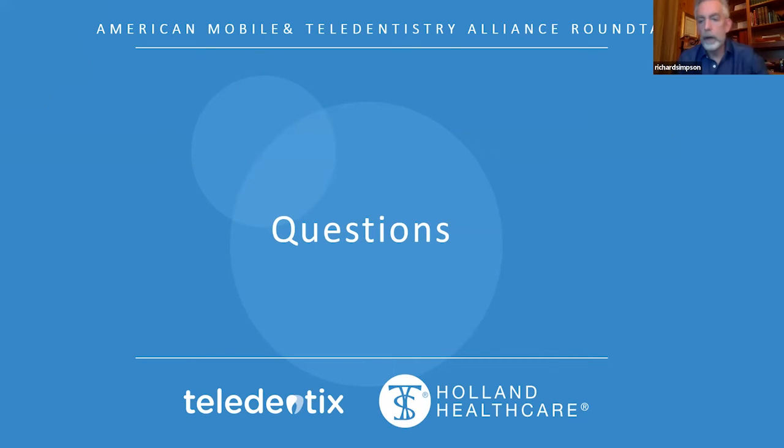Sorry, I was muted. Sure. Definitely, Bill, you can jump in too. He alluded to it some. First of all, I would put a bunch of it in a convenience standpoint: not having to have Wi-Fi, not having to carry a laptop where you're going, not having to be attached to a cord, and then being able to capture larger areas.